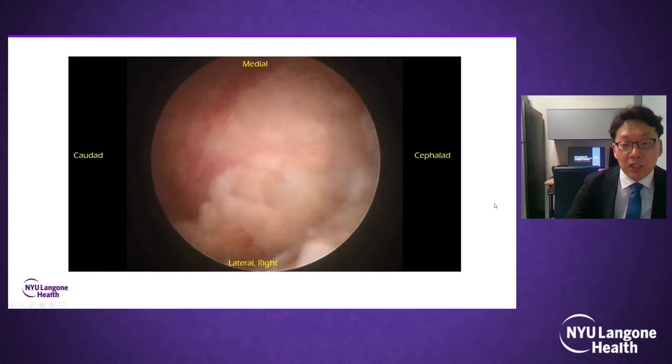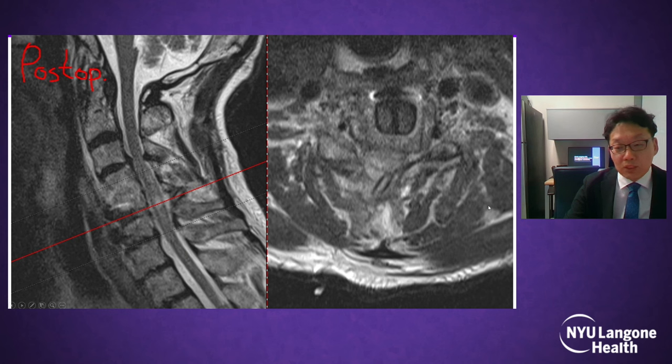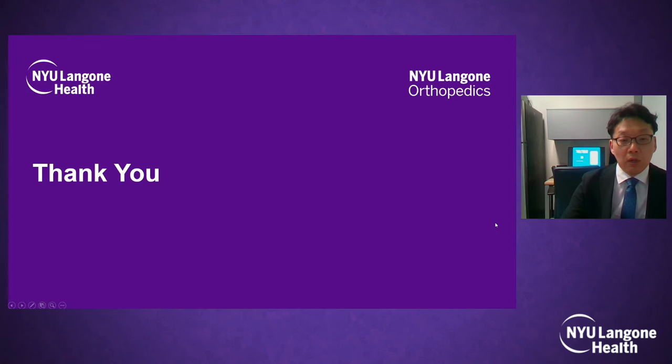After the surgery, pain was dramatically decreased and motor function recovered progressively. There was myelopathic signal change on MRI, and complete decompression was made. Thank you for listening.